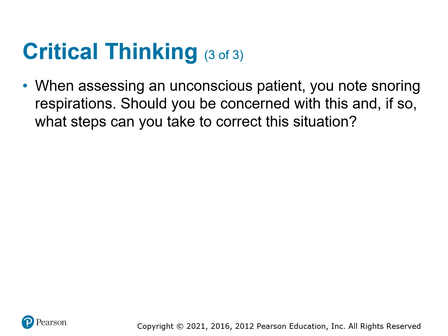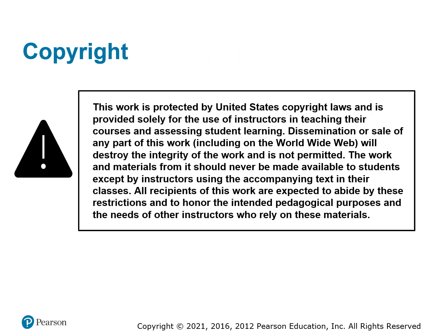You're assessing an unconscious patient, and you note snoring respirations. Remember, snoring is usually from a lack of muscle tone. There are some ways that we can assist, and usually for muscle tone it's going to be your head tilt chin lift or your jaw thrust maneuver. Typically, just better positioning or insertion of an OPA or NPA will resolve this problem.